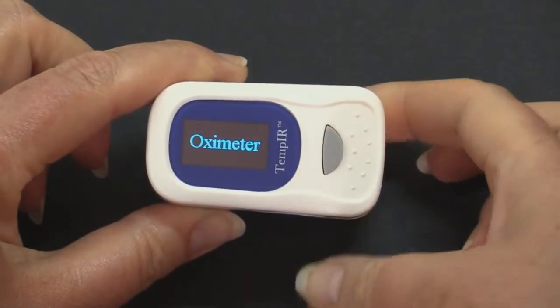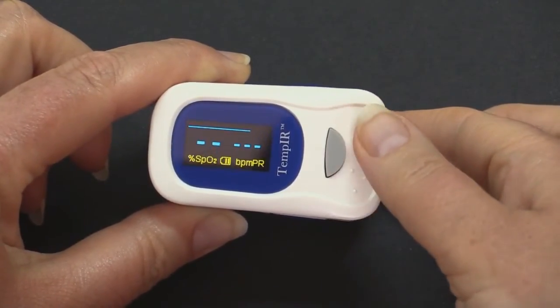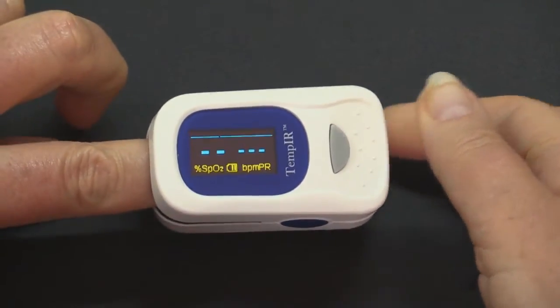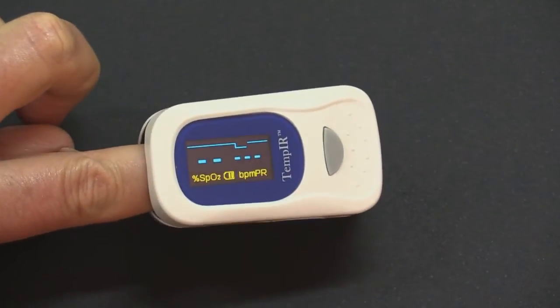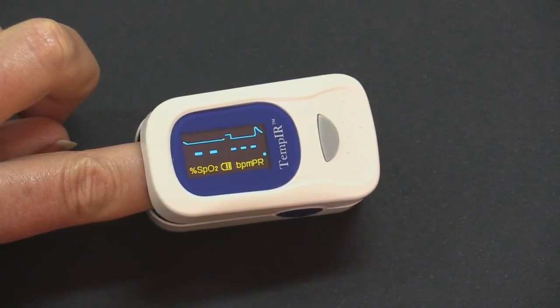Turn the unit on by pressing the button, then place the unit firmly on a finger. It is important you are not wearing any nail varnish, as this will disrupt the readings. Hold your hand still and allow the oximeter to settle for several seconds.